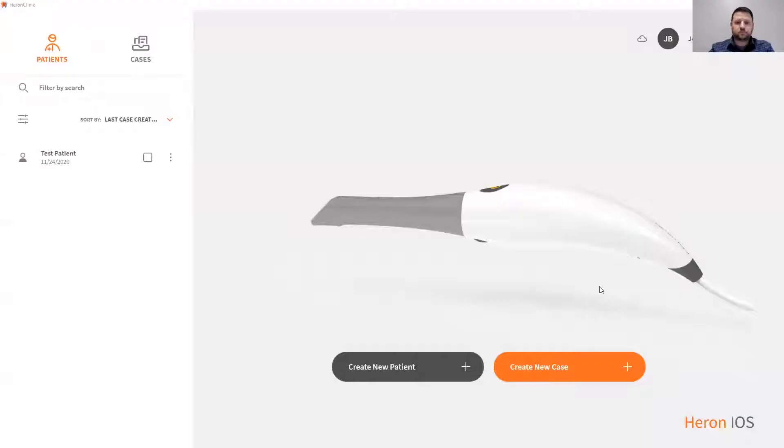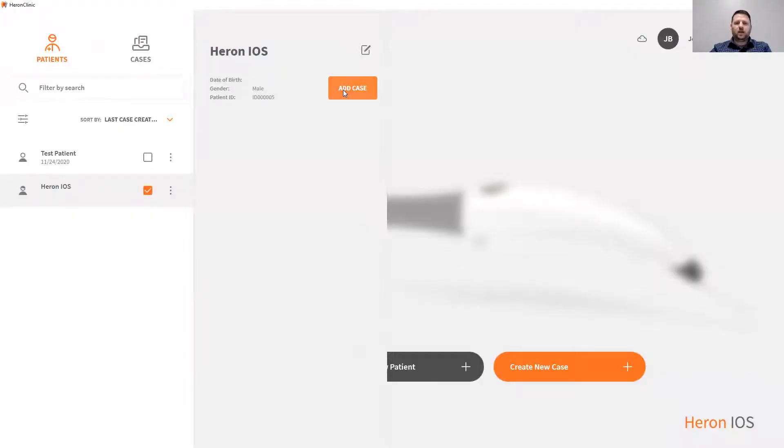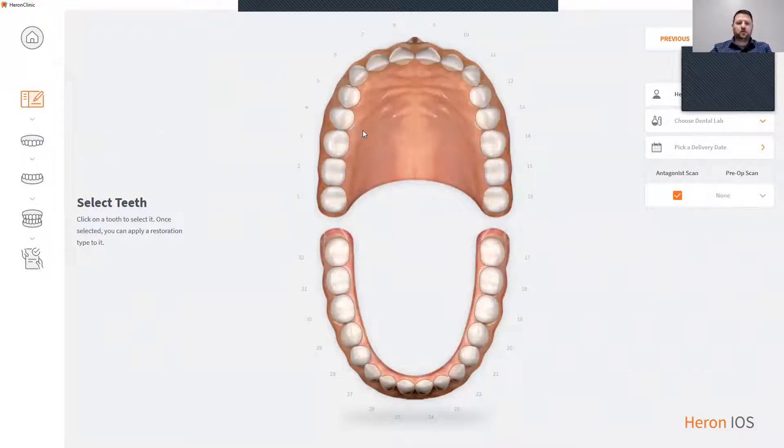I'm now going to demonstrate the Heron IOS software, Heron Clinic. Our software is designed for simplicity. To create a new patient, simply press the create new patient icon. This will now bring you to the patient information. Create new patient, then add a case. This now brings you to our treatment page. To create a treatment, simply press the tooth or teeth that you're going to be working on.